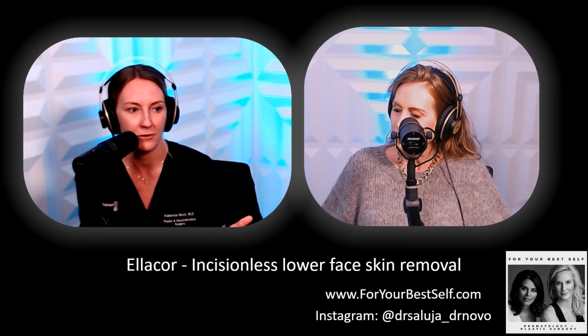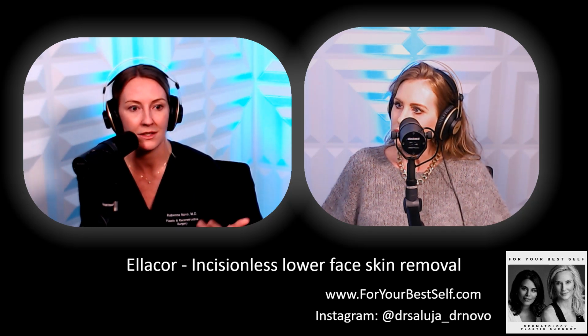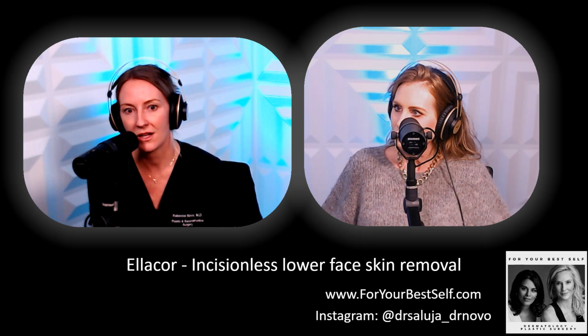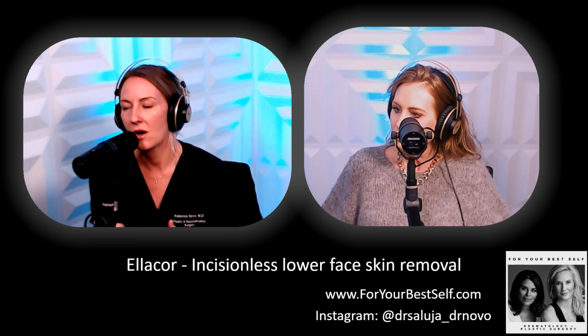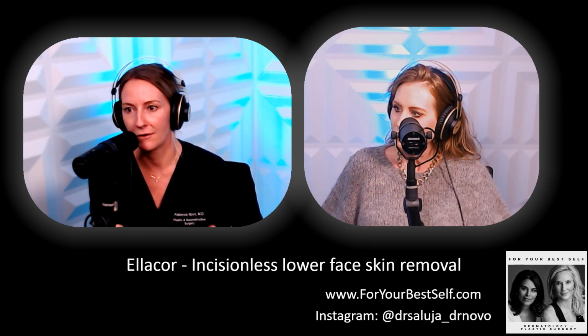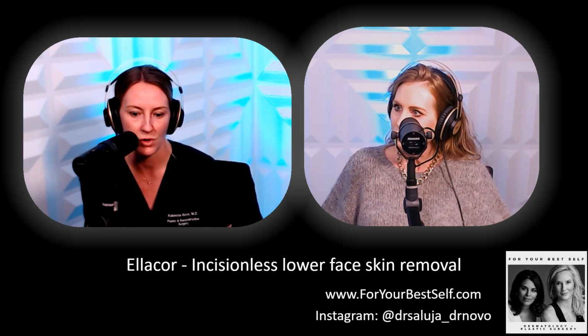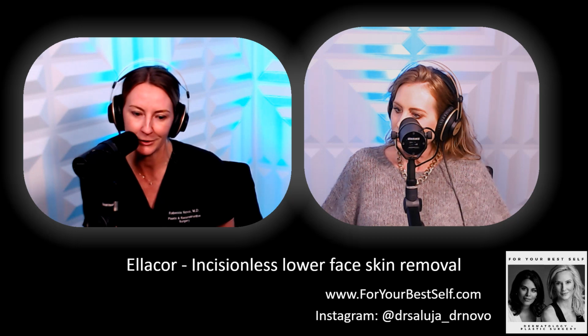This is really for people with good skin quality. Like Heather has good complexion, good skin. The visible health of the skin is good. It's really addressing laxity. So we'll still rely on our lasers and some of the resurfacing for more texture issues, or use these in combination treatment planning. But well, thank you for saying yes.